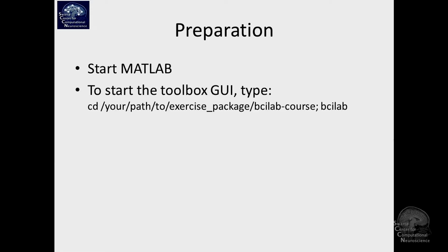So to start with that, the first thing to do is to start MATLAB and then to start the BCI Lab toolbox. When you go to the exercise package on the website and extract it, you basically cd into the directory wherever you extracted this — slash exercise package slash BCI Lab course — that contains all the BCI Lab specific stuff, and then run BCI Lab to start the toolbox.